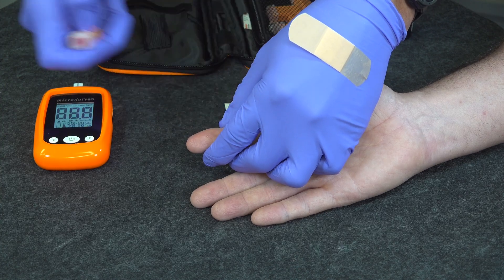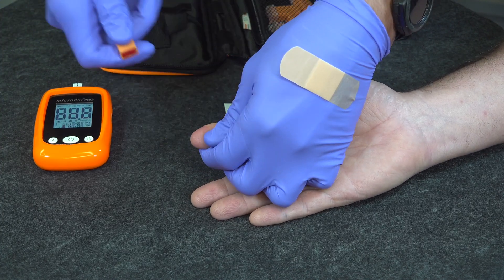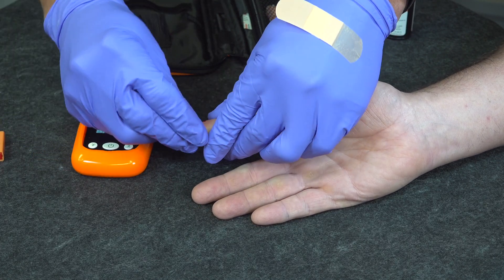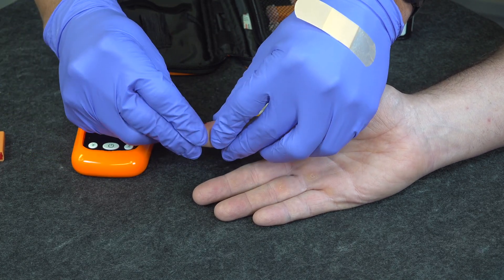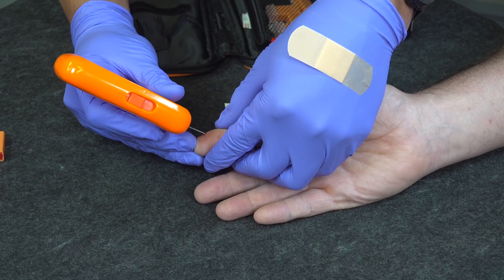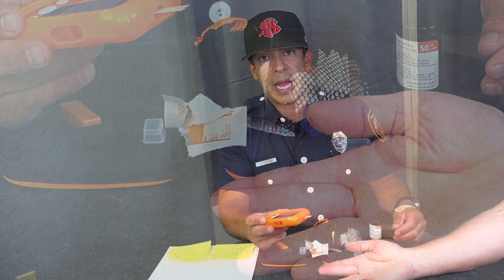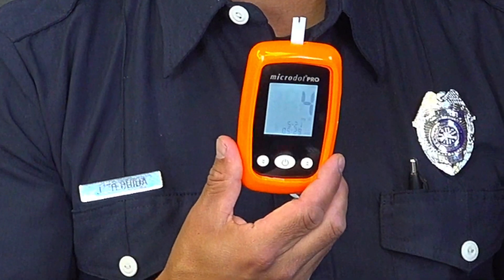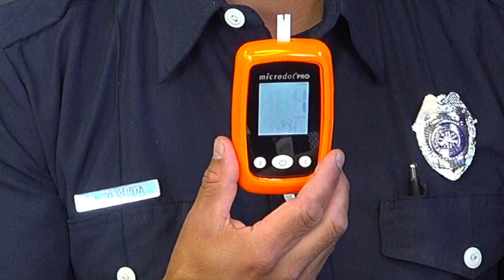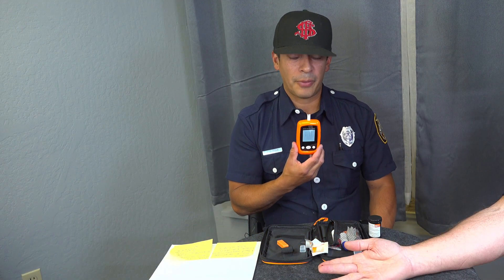Take the lancet out, then go three, two, one — nice and hard and firm. Squeeze as much blood as you can. Some patients are more difficult than others, but about that size is perfect. Then tap the test strip in, hear that beep, and wait for that countdown. It is eight seconds, and as soon as you hear the double beep that gives you the reading — we're at 110, so we have a healthy patient here.